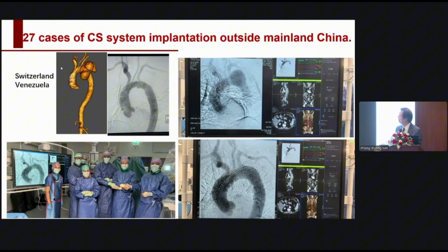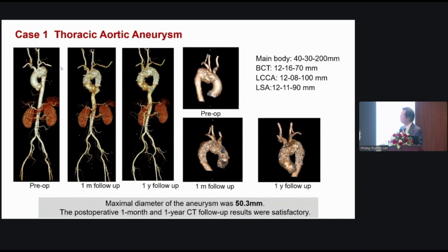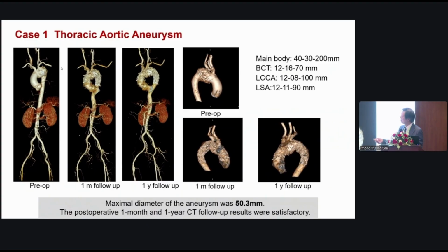So in all my cases, only 1 case suffered a mild stroke. In that case the patient had no symptoms, because in Fuai Hospital, all the cases with reconstruction of the whole aortic arch are sent for a CT scan by the ICU doctor. So after he recovered, the ICU doctor sent him to the CT scan. They found a mild stroke, but no symptoms. So that's all the cases. We have the follow-up. The longest follow-up is more than 4 years. The branch vessel keeps patent. This is the first case we have done.